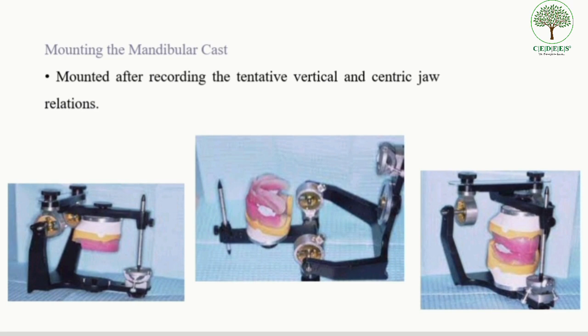The mandibular cast is placed over the lower occlusal rim; it should be soaked in slurry water before mounting. After which, the mandibular cast is attached to the lower member of the articulator using dental plaster. The further procedures are similar to those described in the mounting of the maxillary cast.